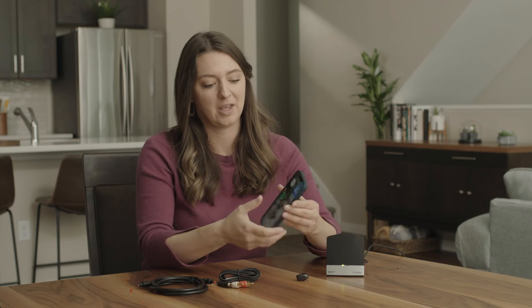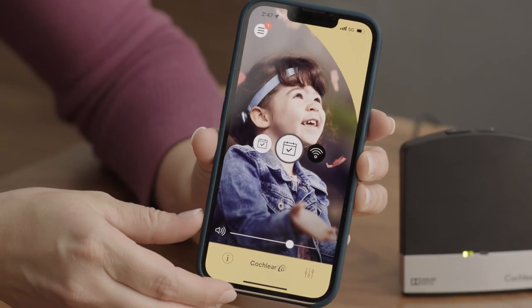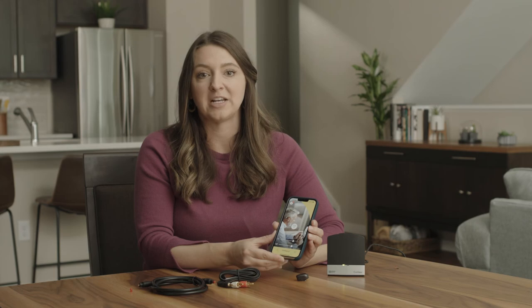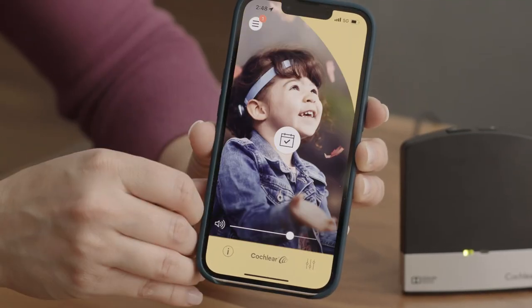You can also activate streaming from the TV streamer using the Baja Smart App. Open the app and tap on the program button, then tap on the wireless streaming icon from the selection of program icons that appear. To stop streaming, simply tap the wireless streaming button again and then select your everyday program icon, or just press the button on the top of your Baja 6 Max to stop streaming.